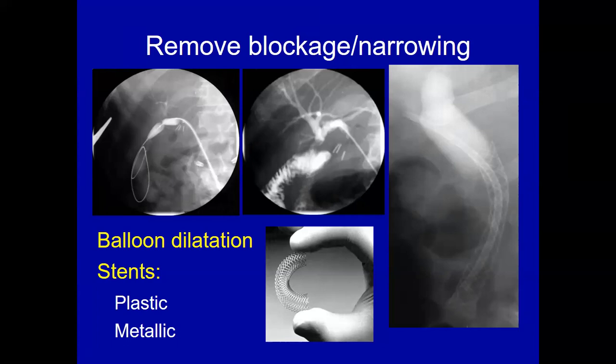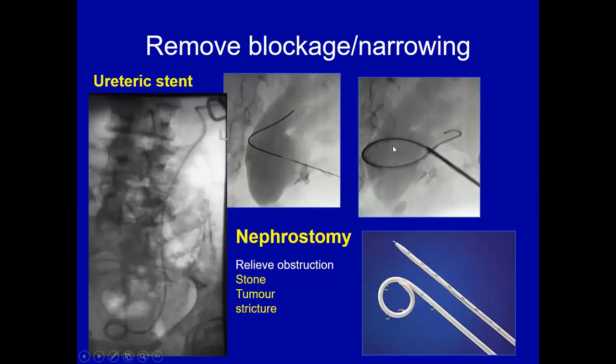Is that clear? Any questions so far? So the way we do this is by X-ray, by fluoroscopy, you are seeing what you're doing. By ultrasound, you can direct the needle inside. Okay. We can remove blockage in the renal system.